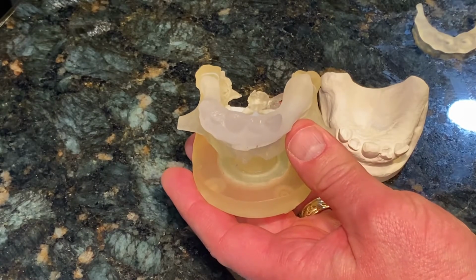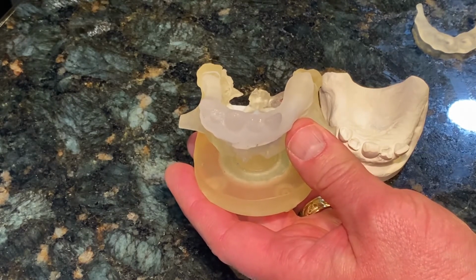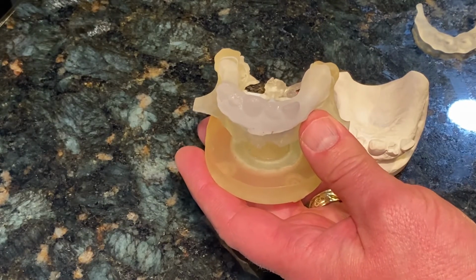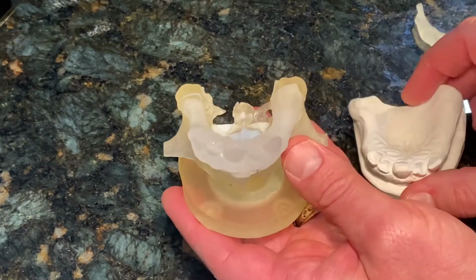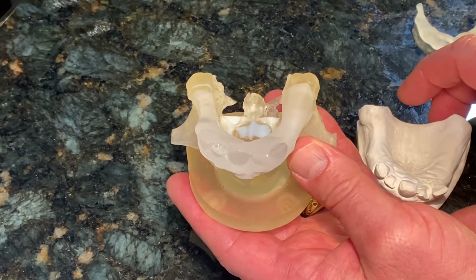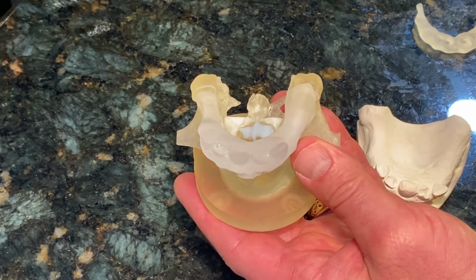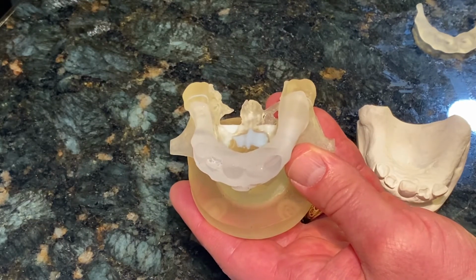This is a case Dr. Gradwell and I worked on together, and Dr. Gradwell places the implants. Me, as a restorative dentist, it's my job to create the teeth that are placed at the time of implant placement. Those are temporary teeth, and then the final teeth at the end of the process. The beauty of this is that I can walk us through the process of how guided implant surgery works based on the model created, because that is the exact same implant position and protocol that's used the day of implant placement on the patient.